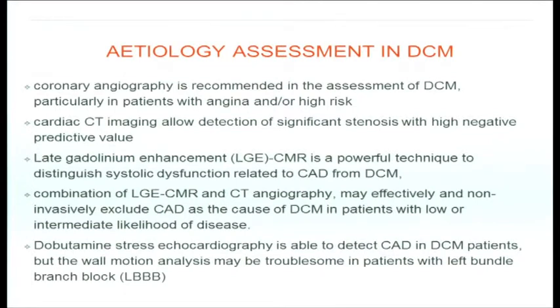Late gadolinium enhancement cardiac MRI is a powerful technique to distinguish systolic dysfunction related to coronary artery disease. The combination of late gadolinium enhancement MR and CT angiography can effectively and noninvasively exclude underlying ischemia causing the dilated left ventricle.